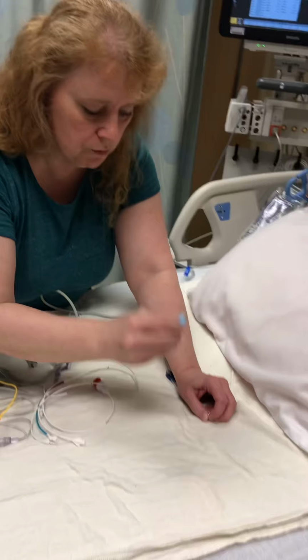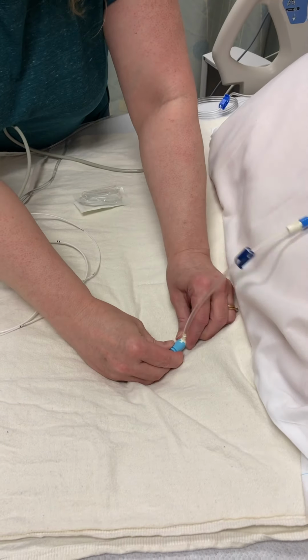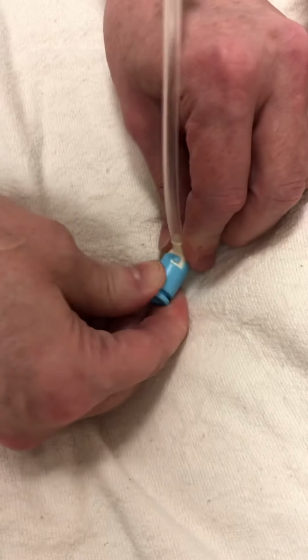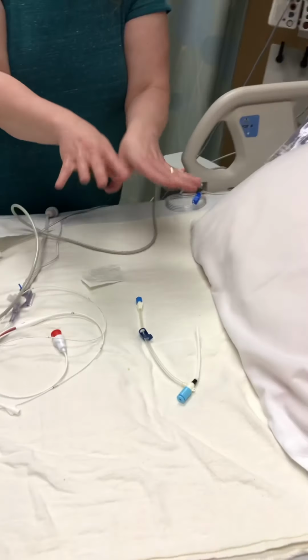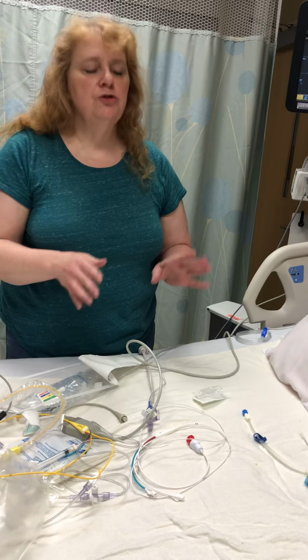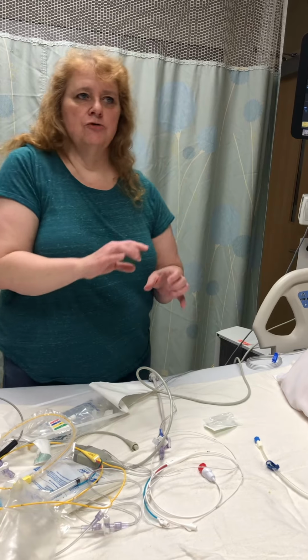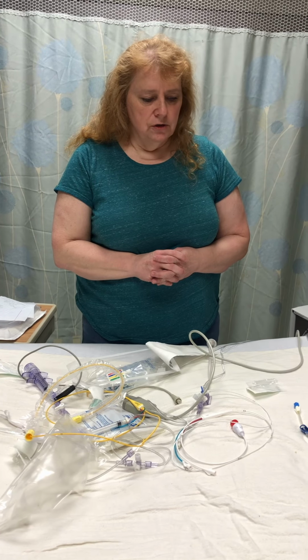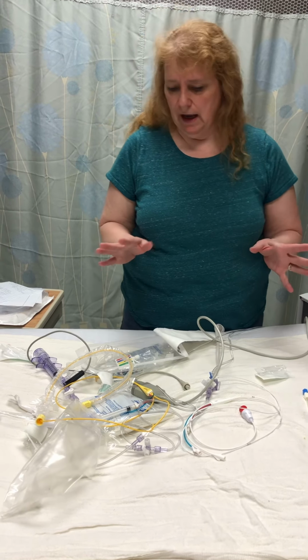And then you're going to put this cap back on here, and this is going to fit into the little notch there. So this is nice and secure. And then you're going to redress this like you would any other central line. If you take out the swan, you really do need to take off the old dressing from the cordis. I have seen times that they try to just put it back on, but from an infection control standpoint, you want to just change out the whole dressing anyhow.